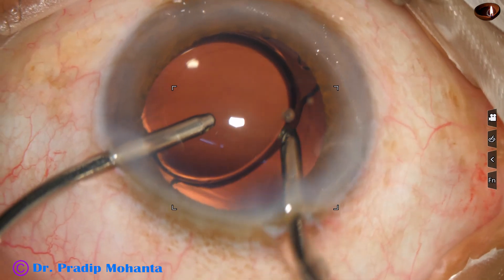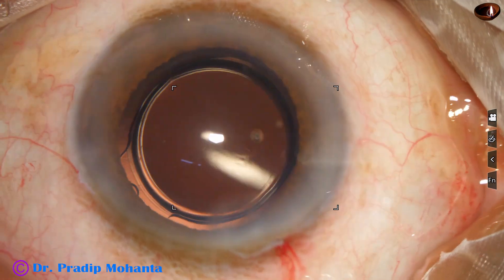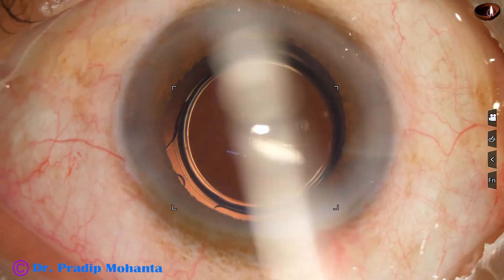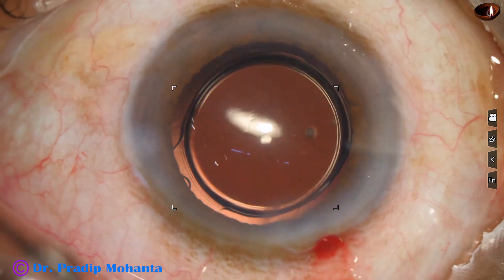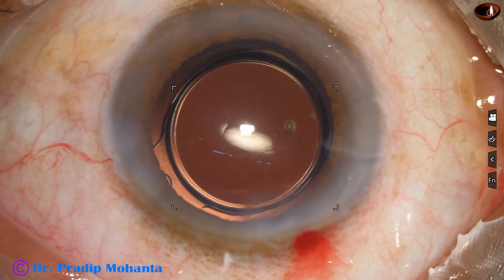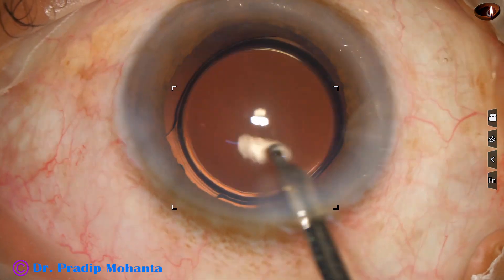A thorough cleaning of visco: if we do a neat job like this, postoperatively the eye is quiet and the patient becomes completely fit in five days, and can do refraction after a few days. After three months, another refraction is done and usually there are no changes in refraction.